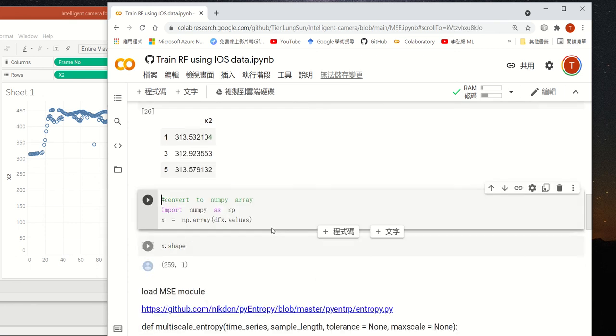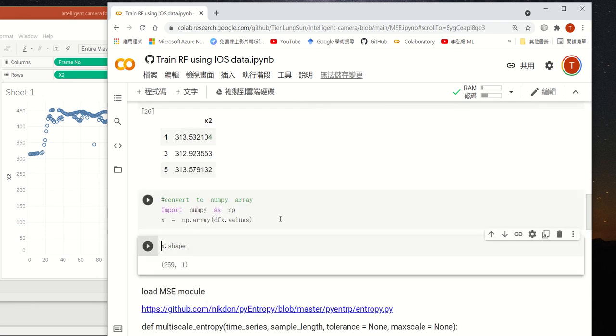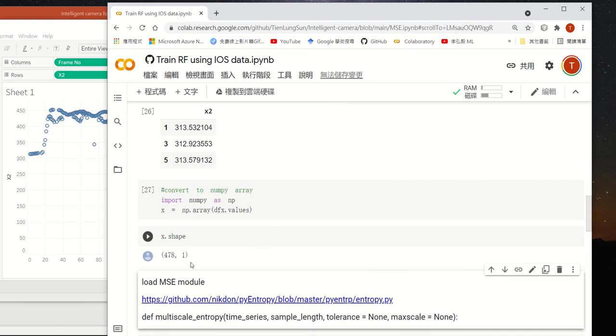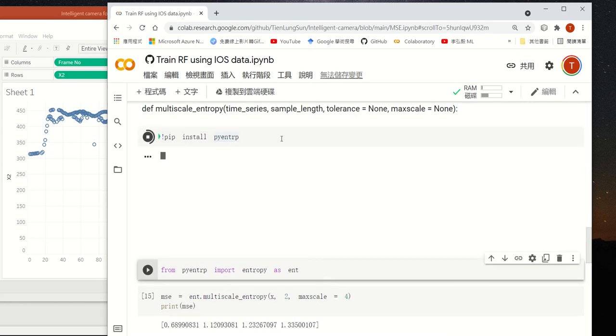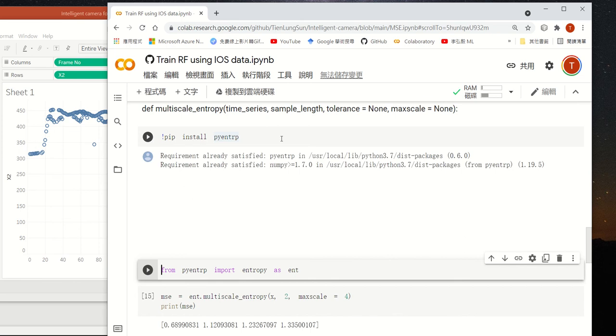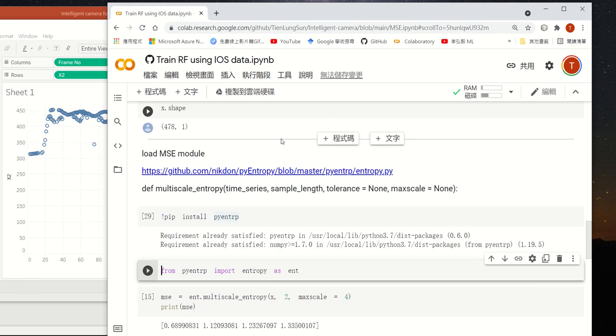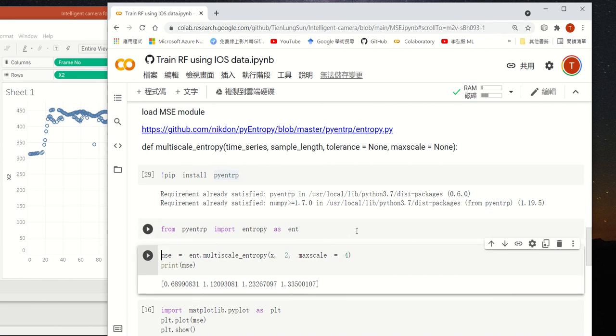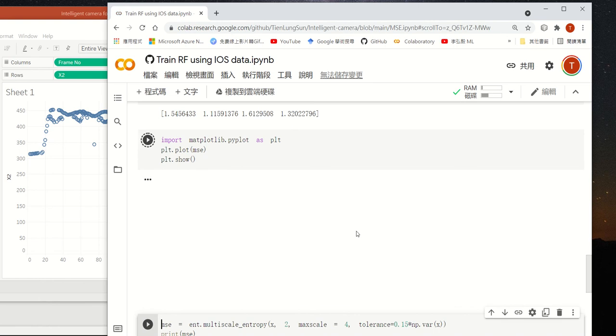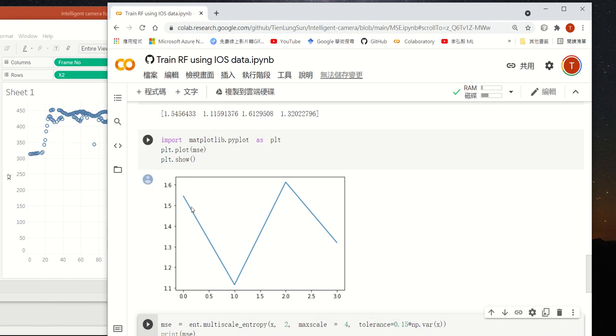Then convert to NumPy. The total data number is 478. You might check in Excel by yourself. Now we install the Python entropy module because we want to calculate multi-scale entropy or permutation entropy and so on. We import, then we calculate and plot. So that's the multi-scale entropy at scale 1, 2, 3, 4.